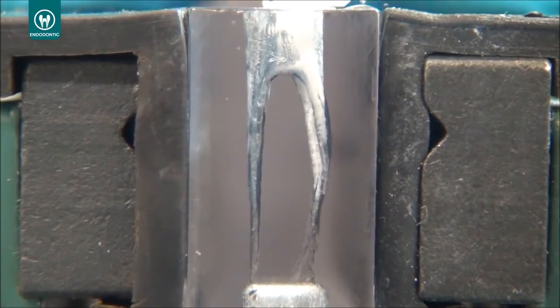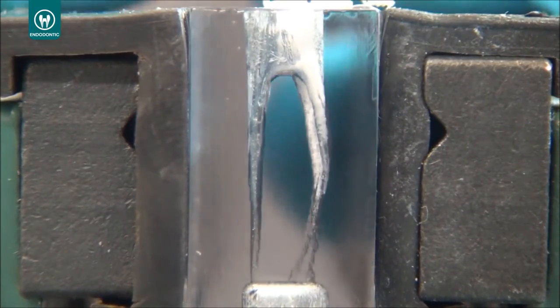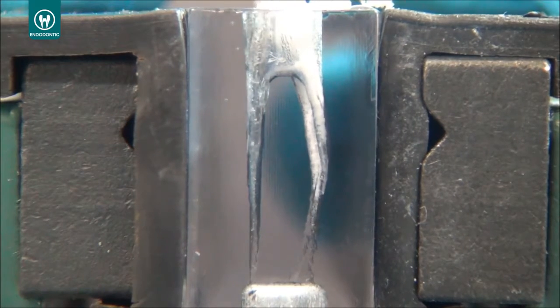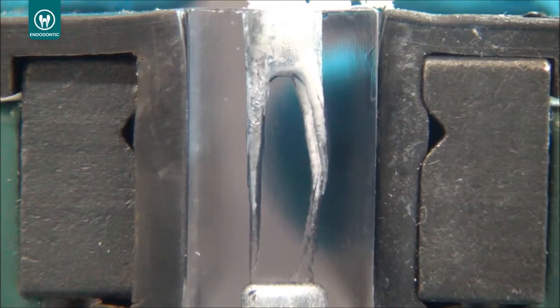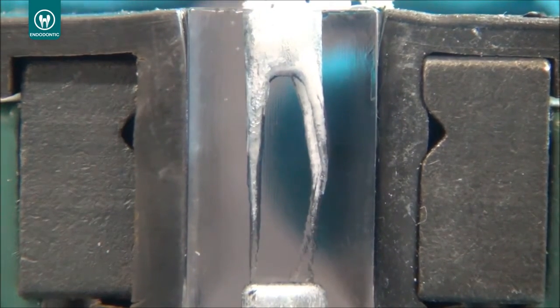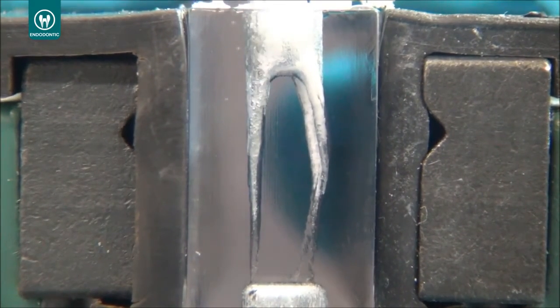Usually we do a scouting with a number 10 or 15 file first of all, just to be sure that we are inside the canals, and then we use the orifice shaper in rotation. Just remember to fill the canal with a lot of irrigant.